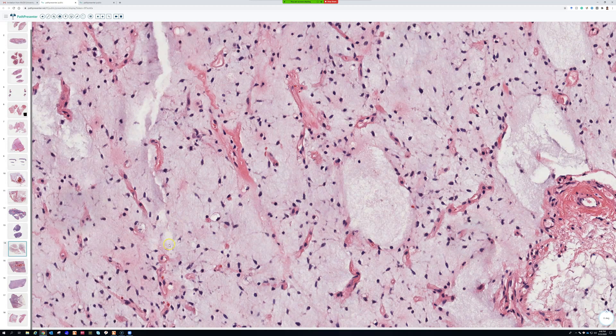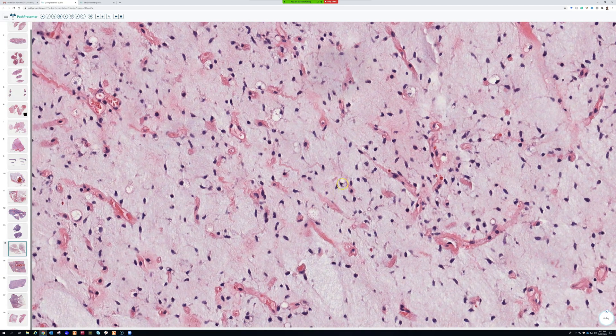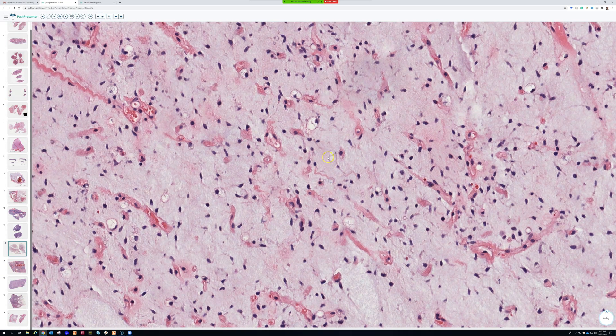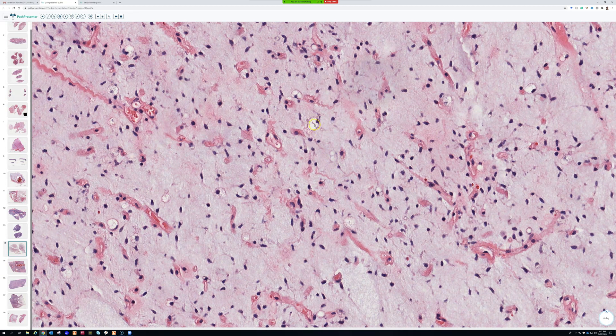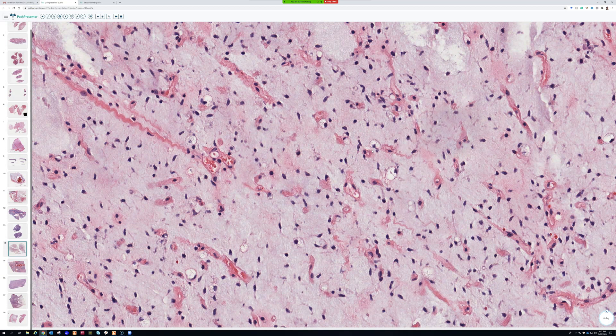The cells are bland, kind of oval to round to spindle, spaced out in a myxoid background. Lipoblasts do not have to be found, although usually you will see them. They look different from the big pleomorphic lipoblasts you'd see in pleomorphic liposarcoma. In myxoid liposarcoma you tend to get little univacuolated signet-ring-looking cells, or some that are bivacuolated or multivacuolated, but with a tiny bland nucleus.